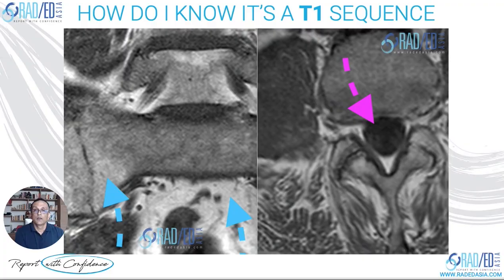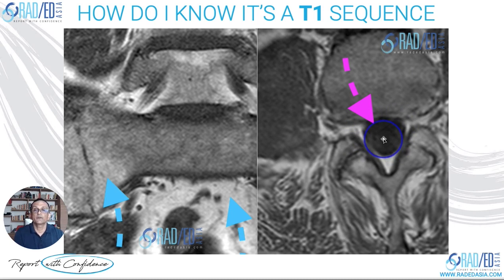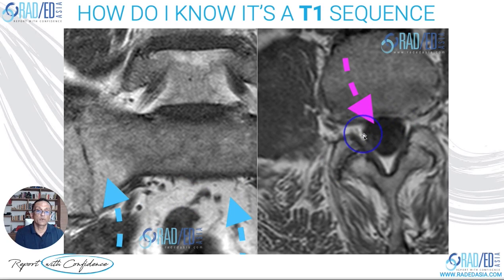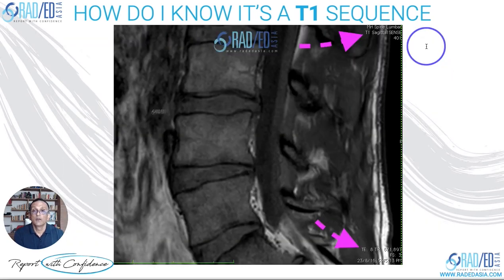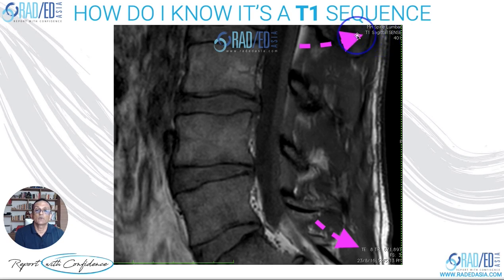Starting with a T1-weighted scan — we're not going to look at the physics. What you need to know is: how do I know when I look at a scan whether it's T1 or T2? The easiest way to know whether it's a T1-weighted scan is to look at the CSF. Here's the thecal sac — the thecal sac contents are black. Fluid on a T1-weighted sequence is dark, low signal. You'll also see that fat is very bright on T1, but this alone isn't enough because T2-weighted scans can also have bright fat. The simplest way is to look at the CSF and see whether it's dark. You can also look at the corners of the images — most commonly they will tell you what sort of scan it is, for example 'T1 sagittal.'